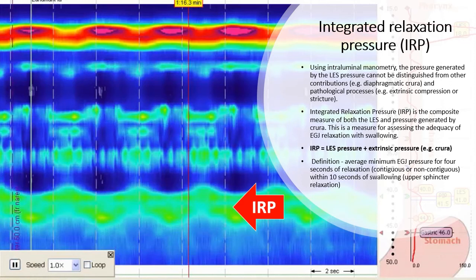This is a measure for assessing the adequacy of esophagogastric junction relaxation with swallowing. This is defined as the average minimum esophageal sphincter pressure for 4 seconds of relaxation, which is either contiguous or non-contiguous within 10 seconds of swallowing, which is indicated by the upper sphincter relaxation.